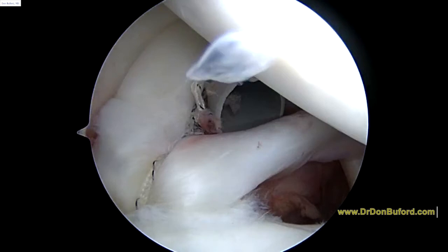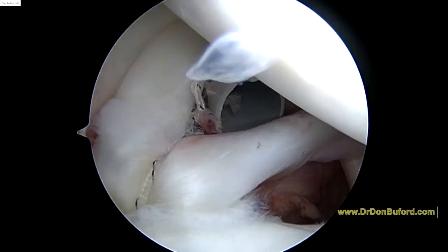So we're going to finish up here and get you back to the recovery room shortly. It's been about an hour, an hour and five minutes, and this ought to do the trick. Your rotator cuff, by the way, at the top of the screen there looks just great — so no signs of any problems with the cuff. Good luck to you now. Bye-bye.